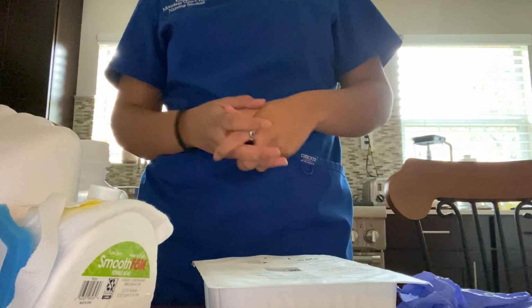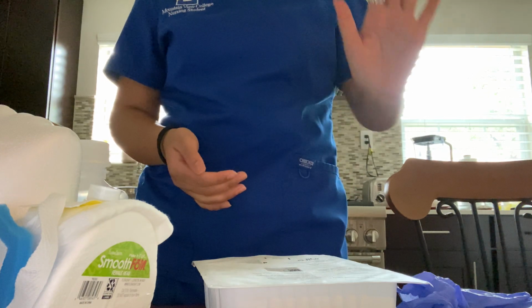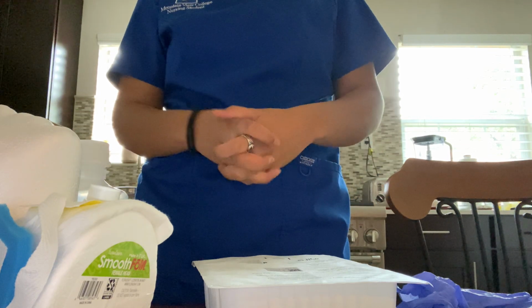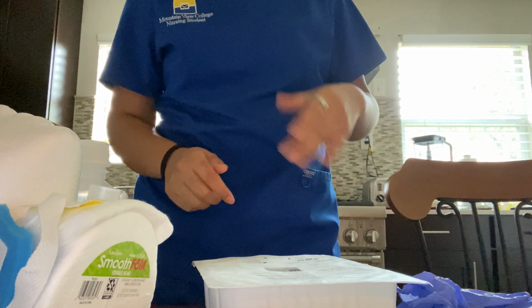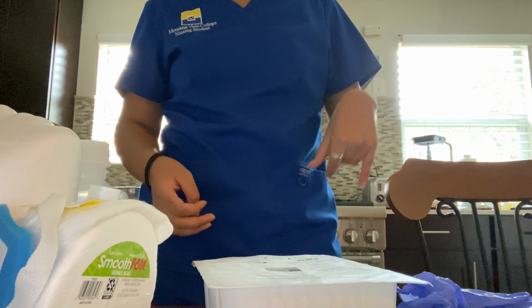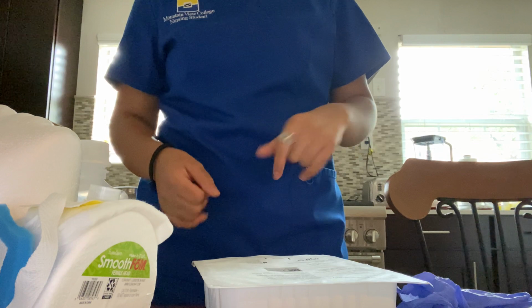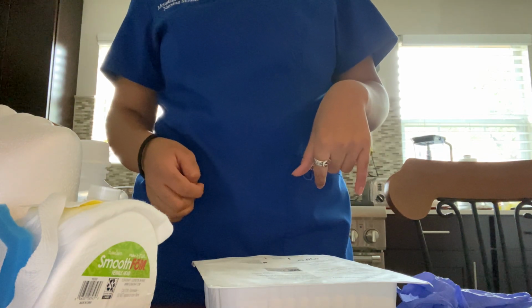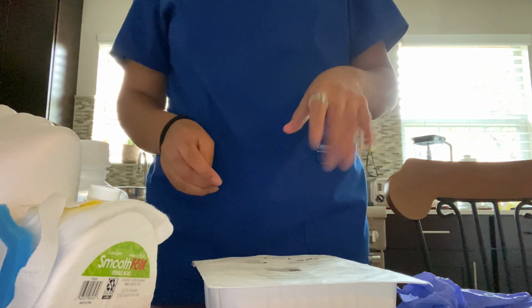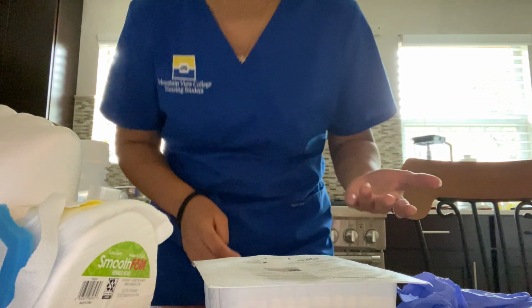You provide privacy and let them know that if they have any discomfort, they can raise their hand to let you know to stop. You will perform hand hygiene and state that, and after you perform hand hygiene, you will let them know why you're there. You'll state that the doctor ordered a suction so that they have a clear airway, and that you're also going to clean around the trach to prevent infection. Then you ask them if they have any questions, and the patient will shake their head no.